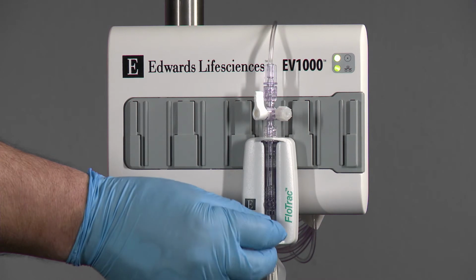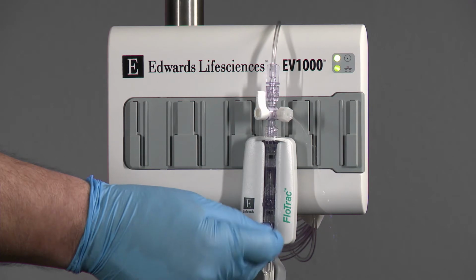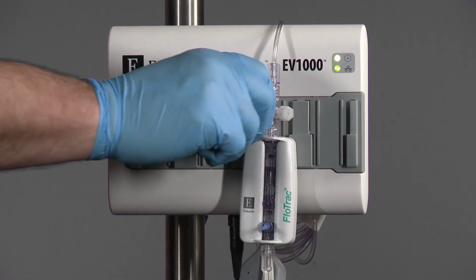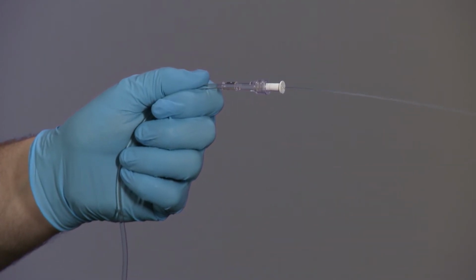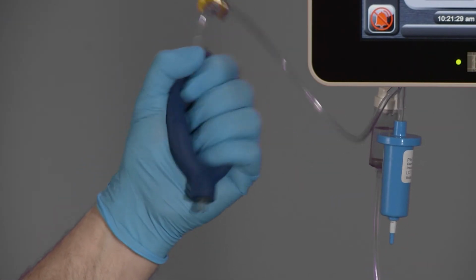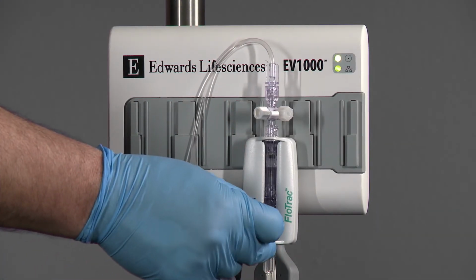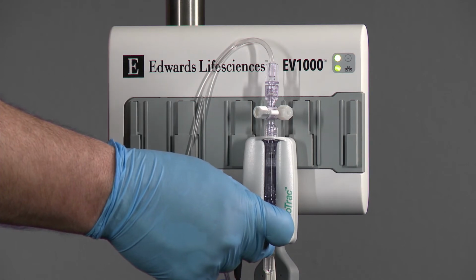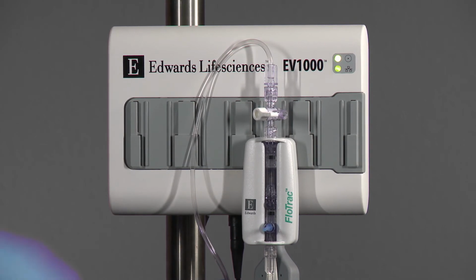Pull the flush tab and prime the FloTrac sensor through to the vented cap just above the sensor, evacuating all air. Turn the stopcock toward the vented cap and flush to the end of the pressure tubing while holding the pressure tubing upright. Pressurize the infuser bag to 300 millimeters mercury. Pull the flush tab for a fast flush and evacuate any residual air. Replace all vented caps in the system with non-vented caps. The above best practice in priming the system will mitigate residual air bubbles.